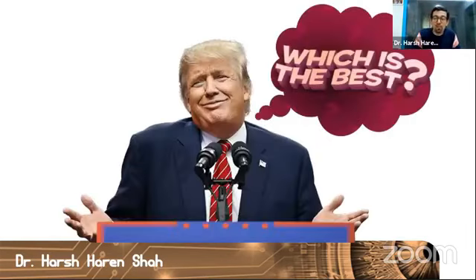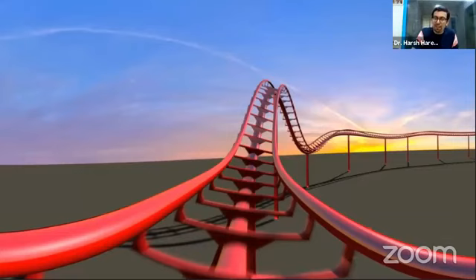And then one common question that I'm always asked is, which is the best rotary file that is available? I'm sorry, this is a very difficult question, and I don't want to get into the difficulties of answering it, because it's a very personal choice. I may choose a different file system for an easy case and a different kind of file system for a complicated case. I may use a completely different file system for a curved canal case, or maybe for a particular case I was using say 2-shape files, and in between I feel the need for a Hero Gold file. I will feel free to mix and match different systems. So this is an individual call that you need to take. Right now we will not have answers for that.